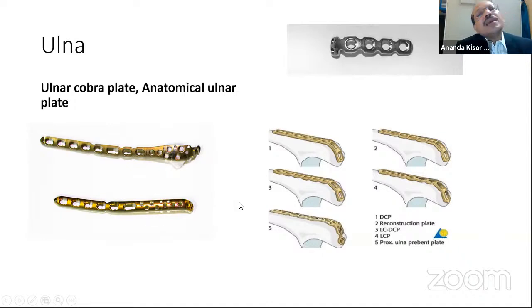In all the plates which are fixed to the subarticular bones, there are basically two types of threads. One is very small threads, the locking threads on one end, which are much more numerous in a cluster, and in the shaft region there is either a combi hole or a locking hole, larger, for the provision of the larger screw. Basically, by this means we have to identify it.